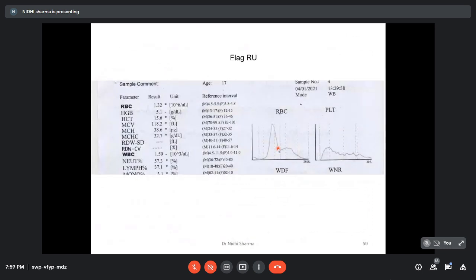Now look at this condition. So we are going to our point check, the lower discriminator has touched the graph well, but what is happening here at the upper discriminator? Instead of this point touching here to the base, to the x-axis, it has shown another hump here. Now this kind of a condition is actually very critical, as I said, you clearly have a cell population which is larger than what you see here.